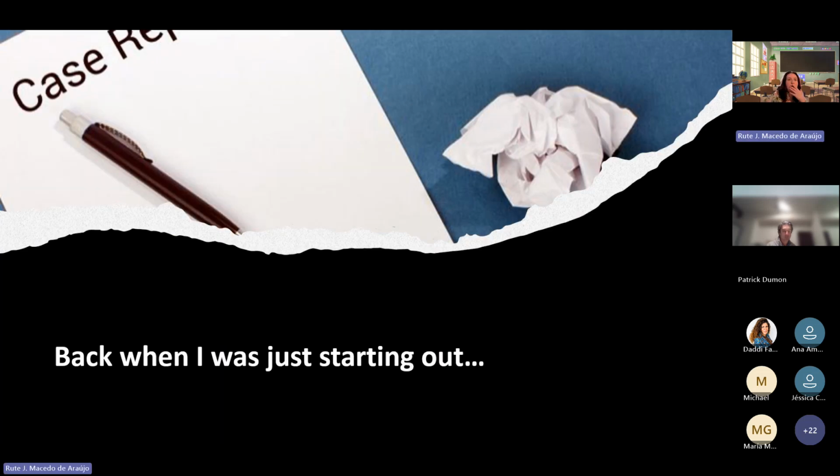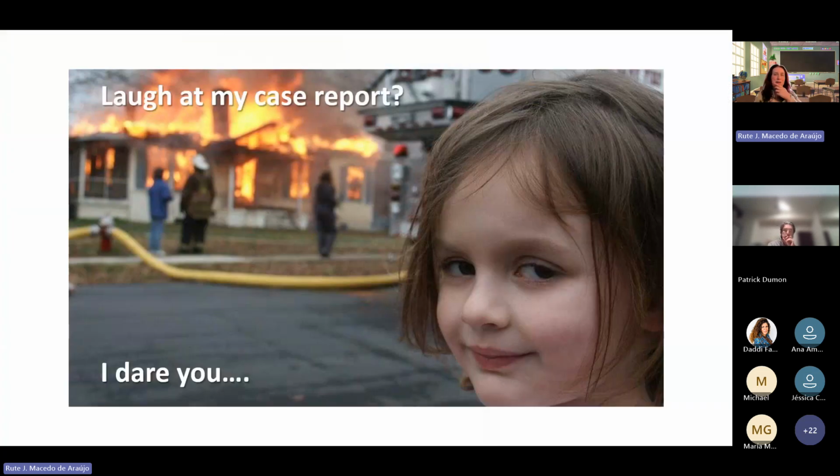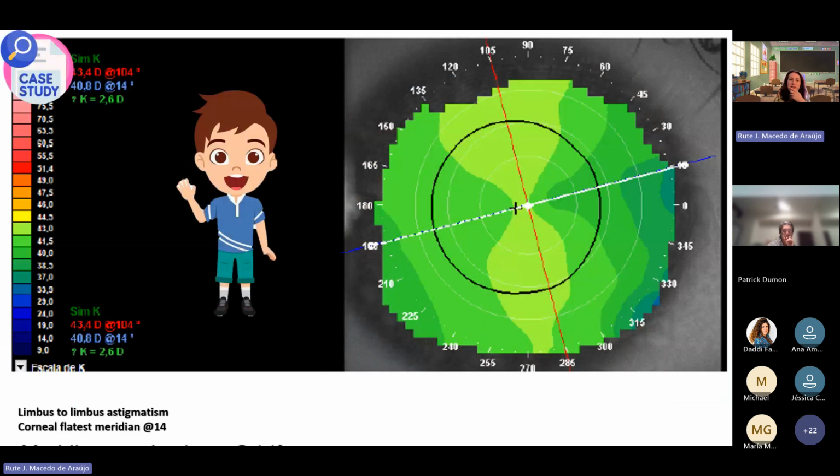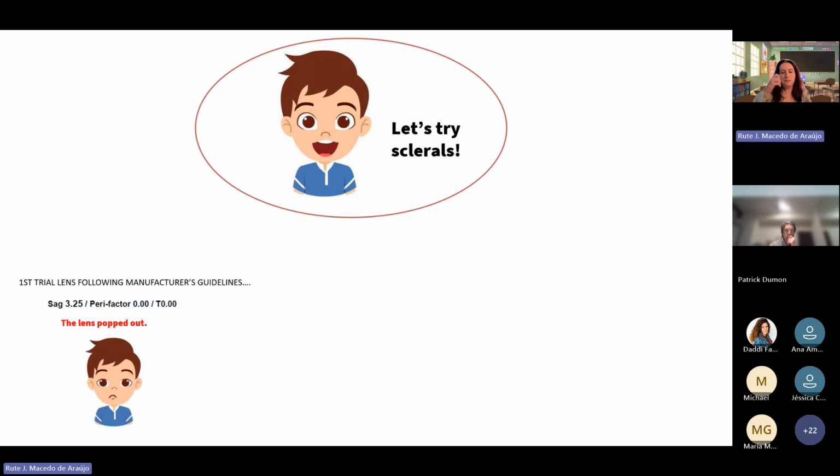Okay, so one case report, I will go very fast through it. This was when I was just starting out. And please don't laugh at my case report, because it is very interesting. It was a male with regular astigmatism, limbus to limbus high corneal astigmatism, and he wanted to try sclerals. The idea was, of course, let's try sclerals without advanced equipment. Here we go, following the manufacturer's guidelines. I was trying to insert the lens, and the lens popped out. And I was like, okay, maybe it's too flat for this eye.